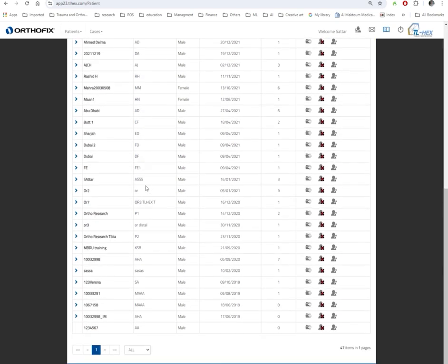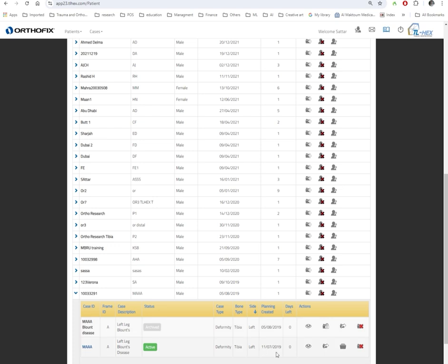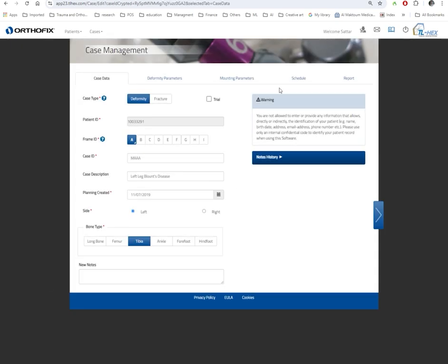I think I did this patient quite a while back. That's him. Okay, I've done him in July 2019. I already archived his data here, but I created a new active folder for this video purpose. So if I click on it, it will take me to this page here, which is the case management. The first tab on the top is the case data, then deformity parameters, then mounting parameters, schedule, and report. So we have to fill each of these tabs separately.